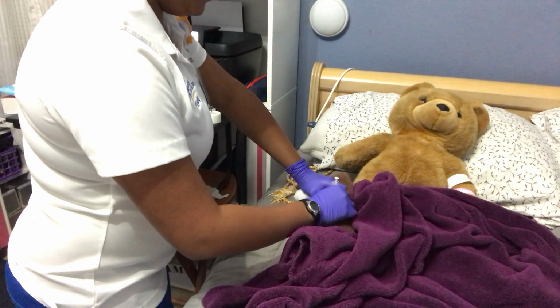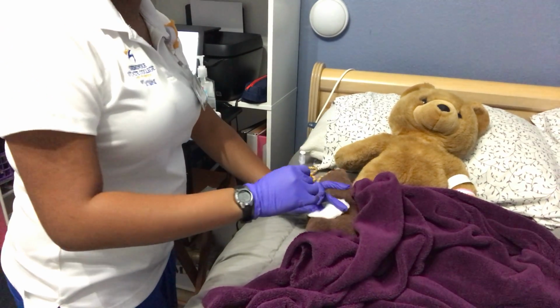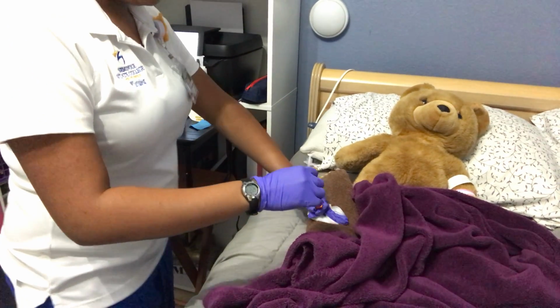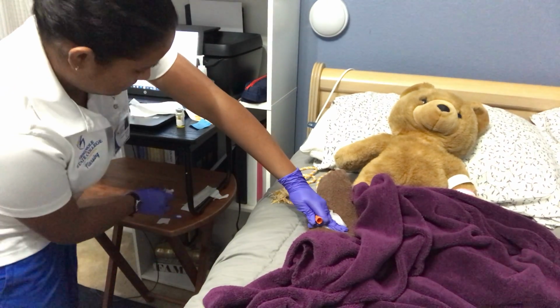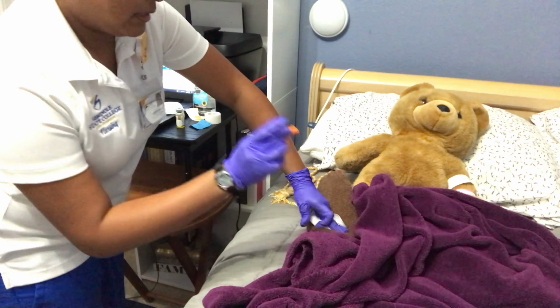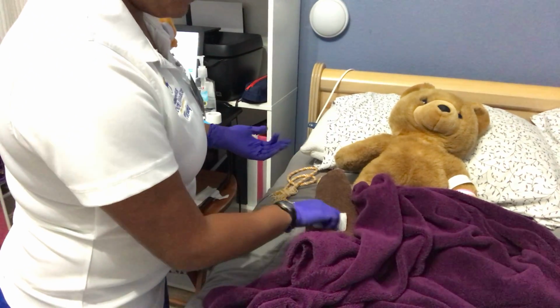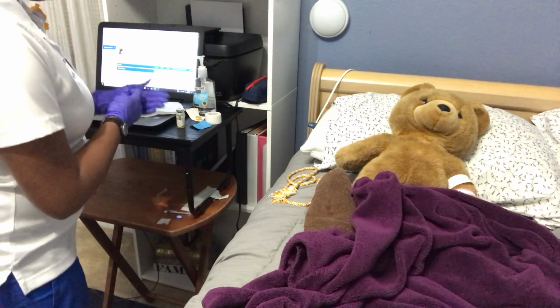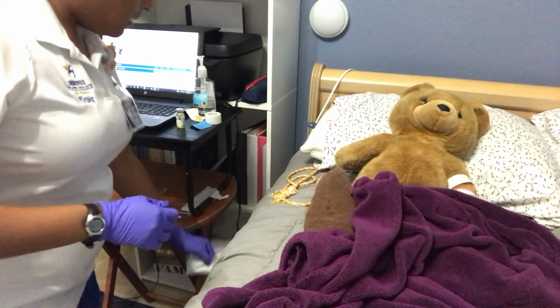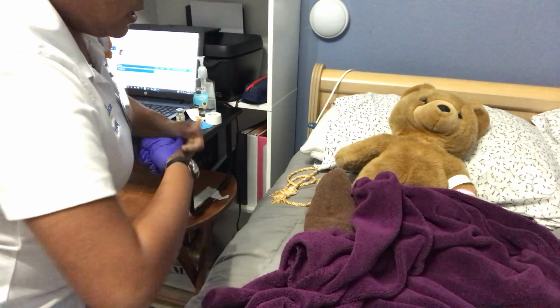Okay. So now that I put it in, I'm going to let go, take it out, and hold it for bleeding. Alright? I'm going to put the safety on this, and I'm going to put it in the dirty syringe container. Now look, the cap also goes in there. Alright, I hold. Alright, he stopped bleeding. I'm going to dispose of it. I'm also going to dispose of this. And I'm going to dispose of the gloves.